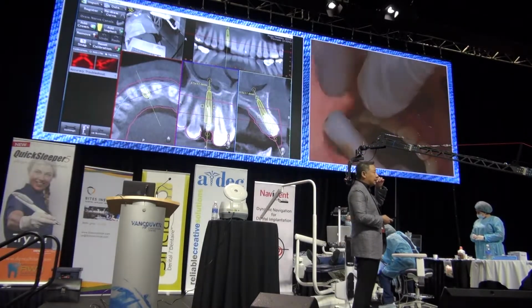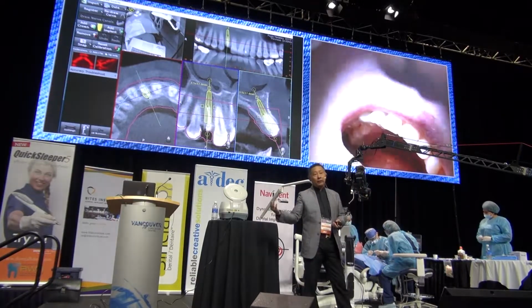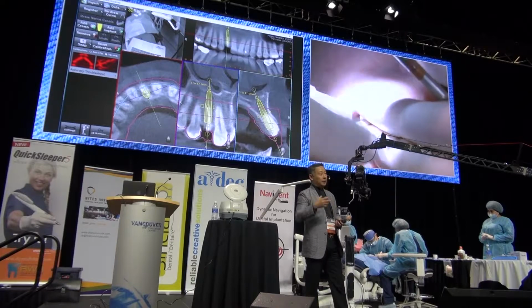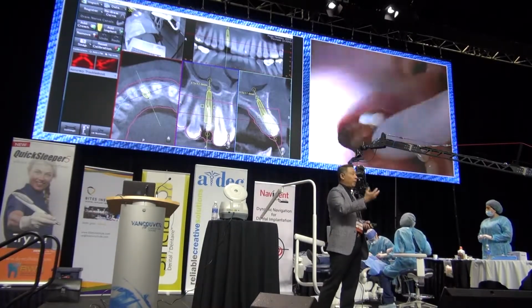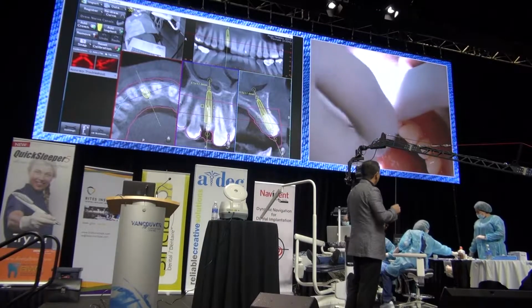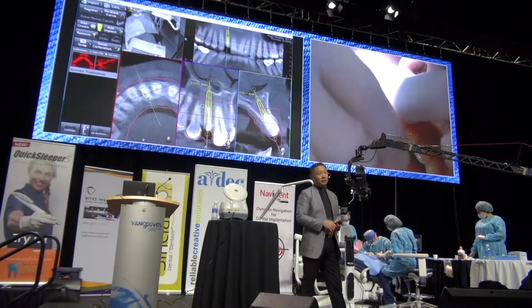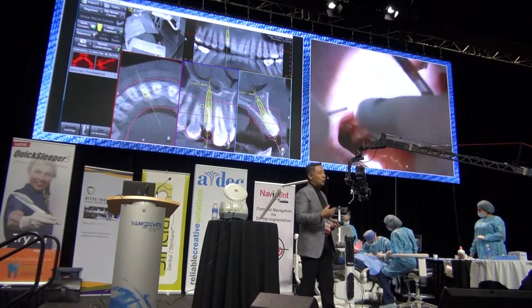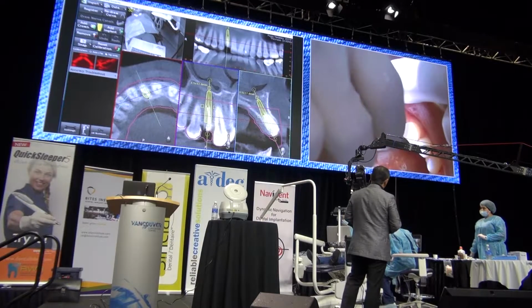Why? Because by design, I want the weakest interface between that provisional to the implant. I don't want the patient to load between the implant and the bone. So if the patient comes back after a month or 2 and they say something is loose, I know they haven't been compliant. And I remind them, please know that this is not ready to be fully loaded and don't bite on anything hard.